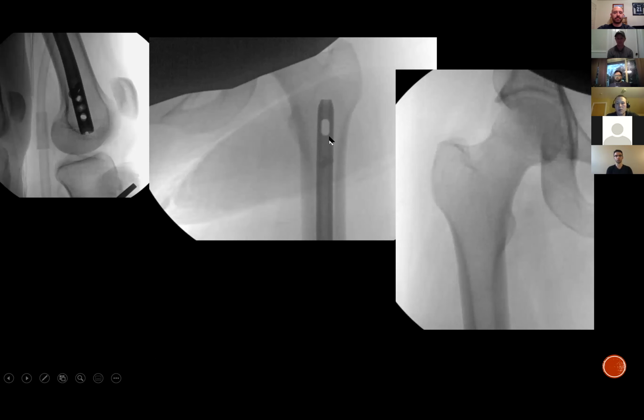Okay, so here I've put up our injured side next to our good side. And you can see, I think that these profiles look pretty close. If I'm being hypercritical, maybe a little bit less of the lesser trochanter is visible here compared to here, but pretty good.